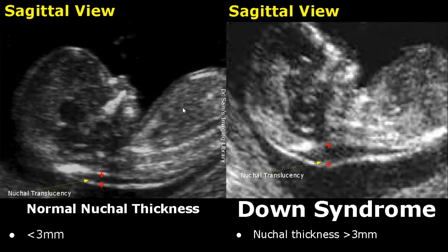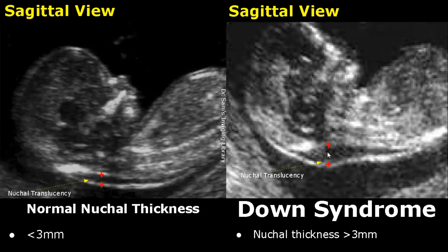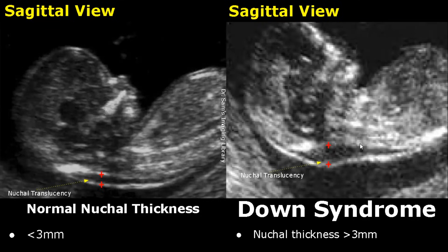This is a normal image of a fetus in the first trimester, showing a normal nuchal thickness. The normal nuchal thickness in the first trimester is less than three millimeters approximately. Over here we have a fetus with increased nuchal thickness — it will be greater than three millimeters in the first trimester. Increased nuchal thickness is a soft marker for Down syndrome.